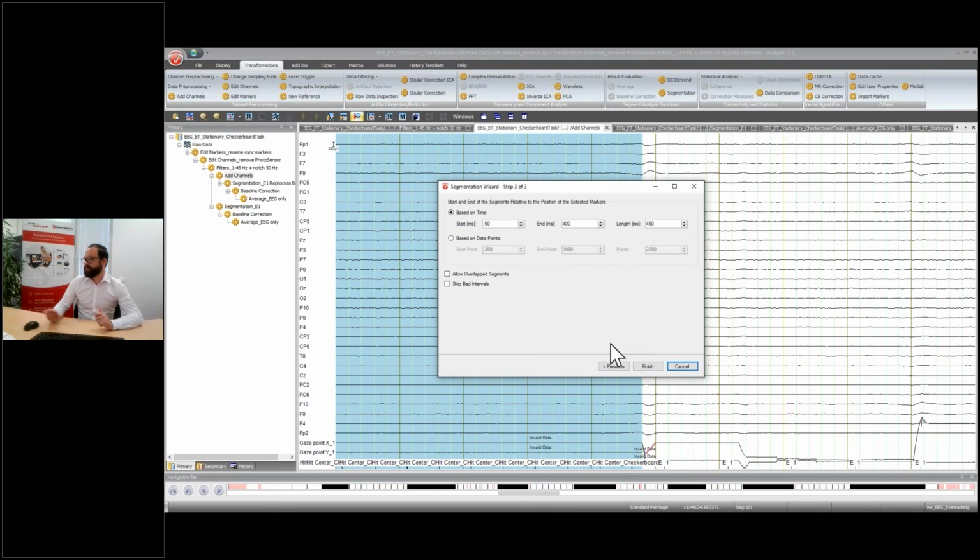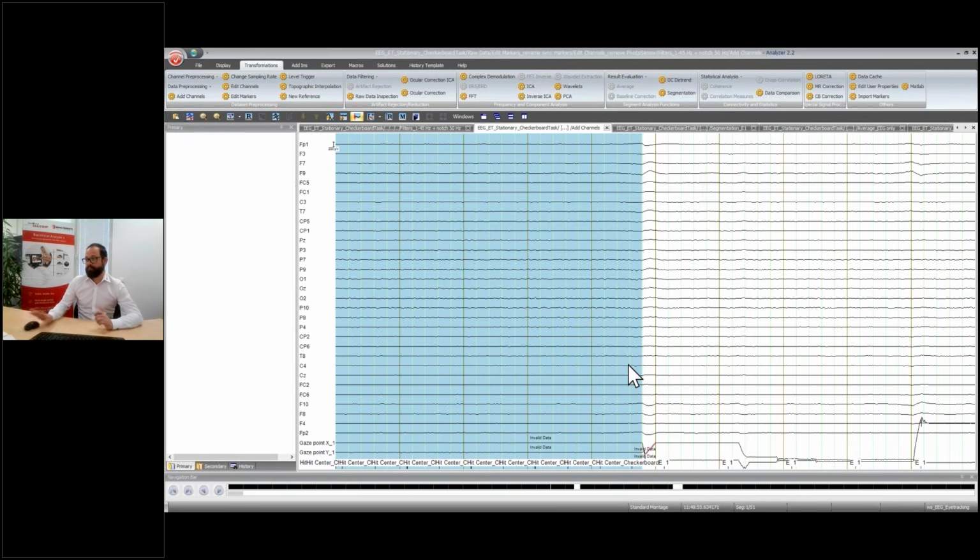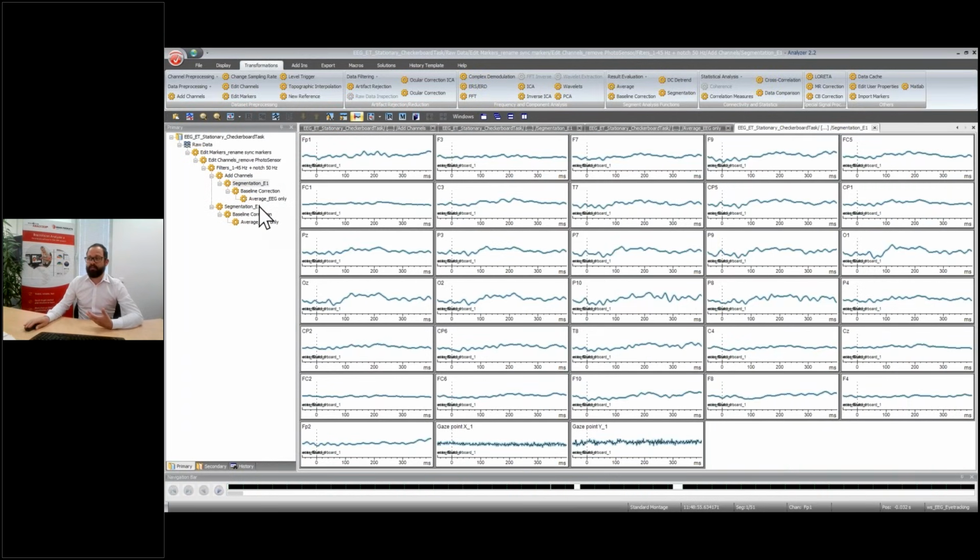And let's then go to the next page where we have again the settings for the interval length, and I will just keep them. So as I said, this is now recalculating, and it will have an effect on the following nodes. So the thing we see right away is we're now having 51 segments, because our subject kindly looked away in half of the trials. So we have a very nice balance, like 50 trials that were really attended versus 100 trials where half of them wasn't really attended.